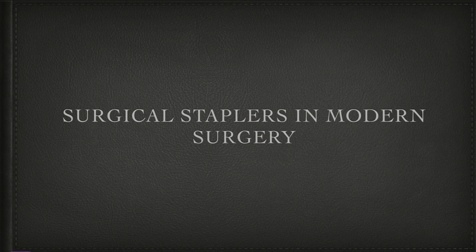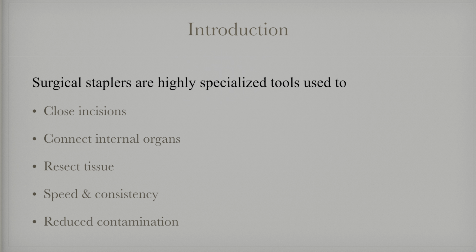Hello everyone, now we'll discuss surgical staplers used in modern surgery. Surgical staplers are highly specialized tools used to close incisions, connect internal organs, resect tissue, increase the speed of the surgery, maintain consistency and reduce contamination.